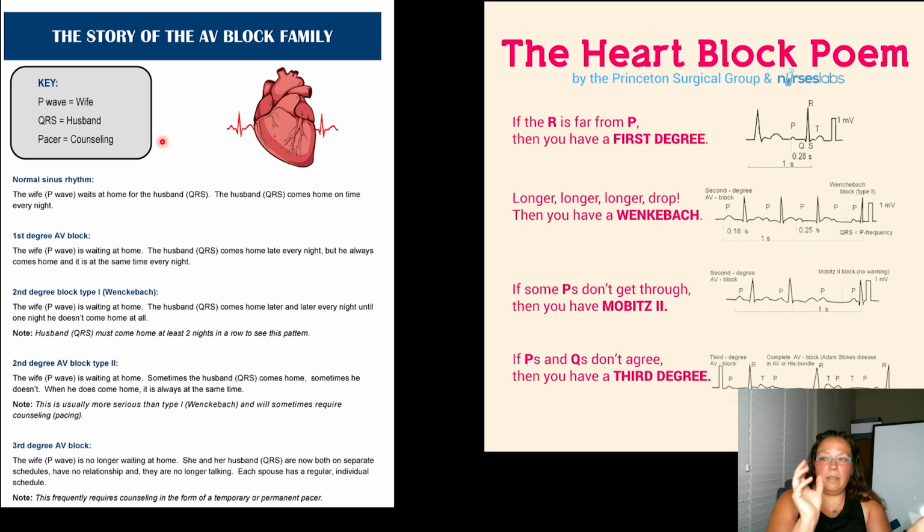Not every P wave has a QRS, and sometimes your P wave is meshed into the QRS. And we'll take a look at that. So now let's get into it. Kind of keep that in the back of your mind.